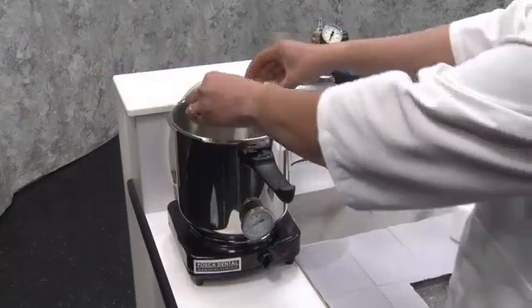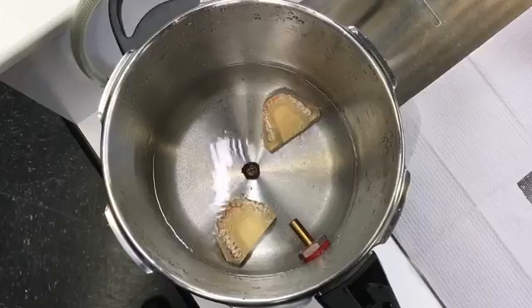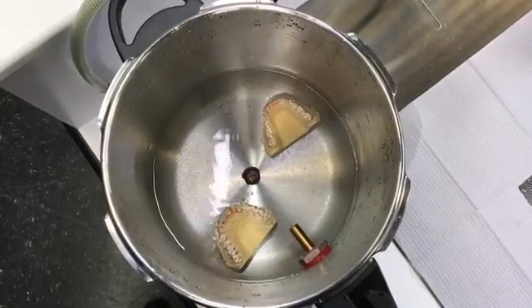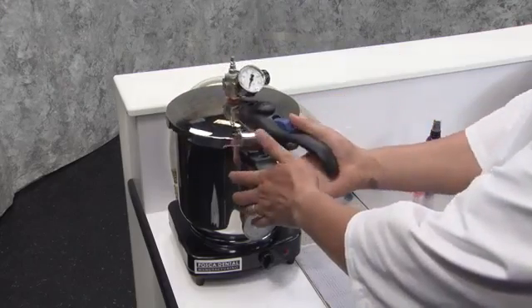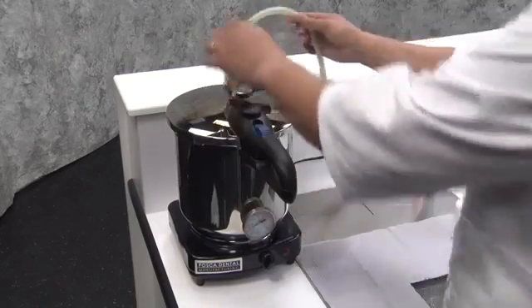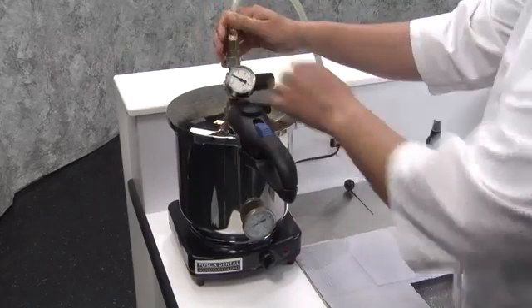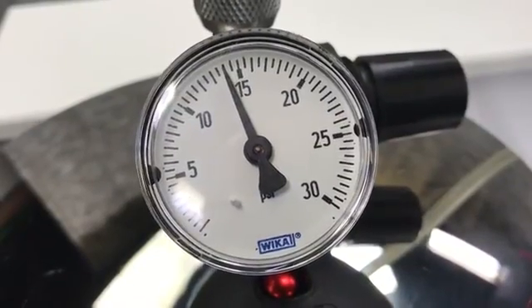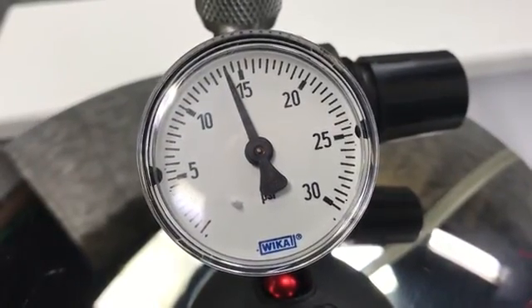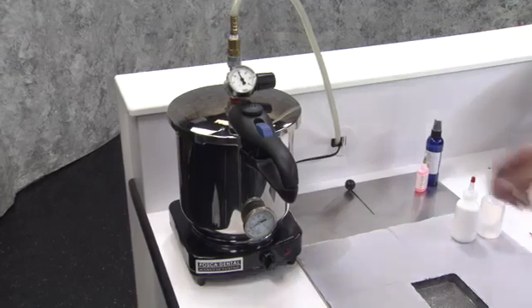Put the models into a pressure pot. This will aid in curing the acrylic. Lock the lid onto the pot. Attach the compressed air line. Air pressure should be between 13 and 23 psi. The water temp should be 85 degrees.